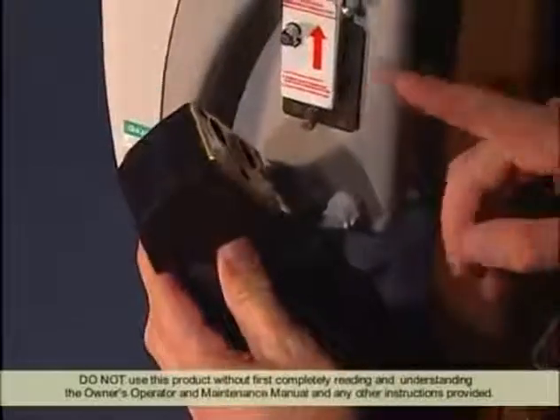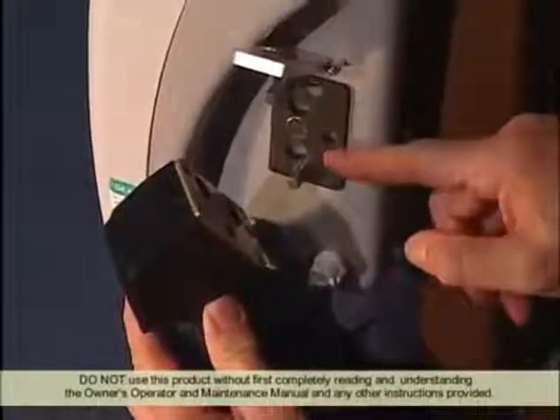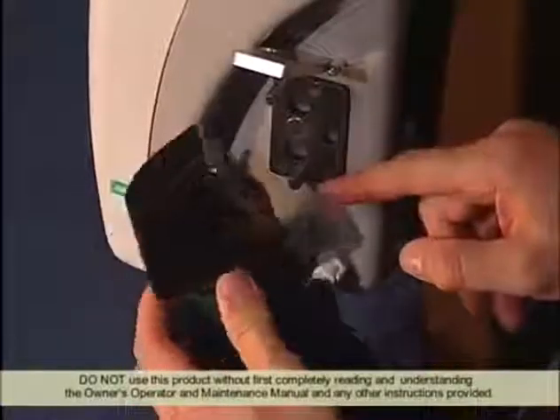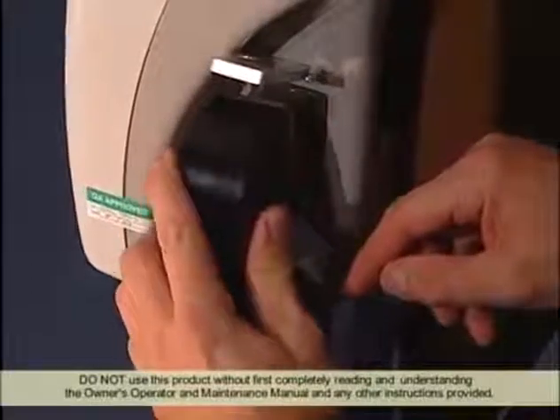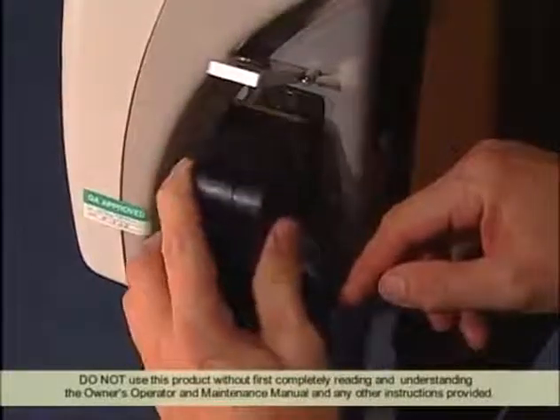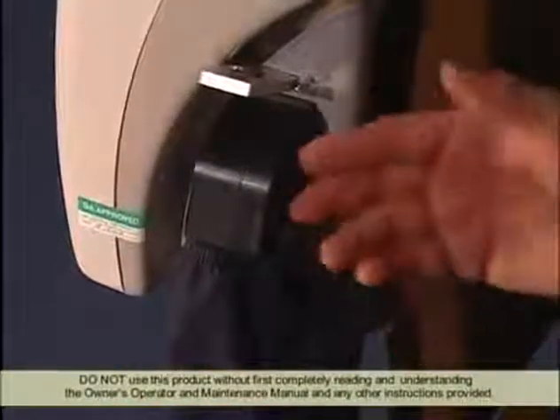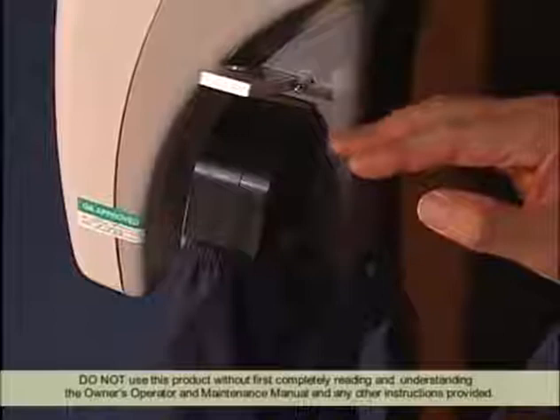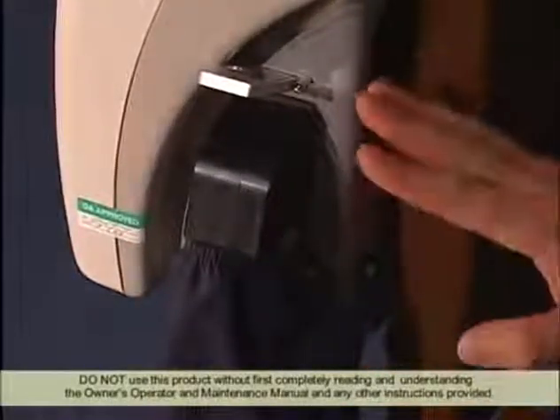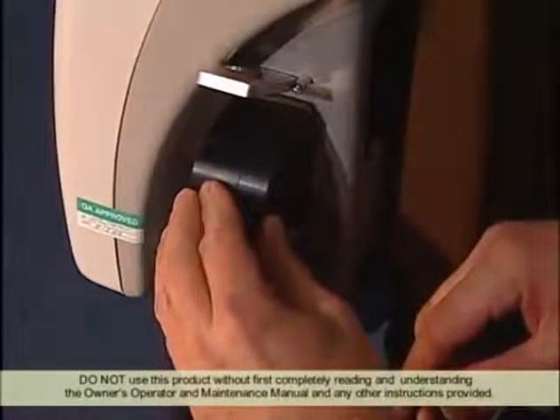To attach it to the blower, lift up this flap. The flap is there to keep out dirt and debris. Then simply line up the two holes with the pegs that are on the power unit and snap it into place, and it's on. If it's not on correctly, you'll know it right away by hearing air leaking out of it. If this hose is tilted or something, you'll know it right away. Just make sure there are no obstructions and that the connector is seated properly.